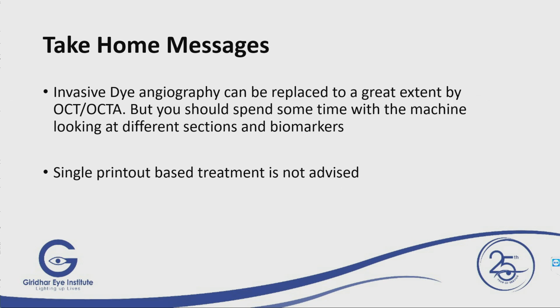So, take-home message: invasive dye angiography can be replaced to a great extent by the OCT and OCTA combination. But you should spend some time with the machine looking at the sections and biomarkers. A single printout treatment is not advisable.